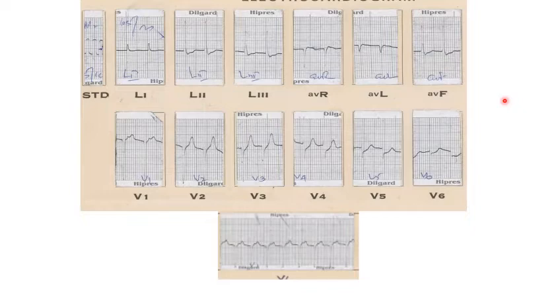And then there is a narrow complex tachycardia, sir, in which P waves we can see just after the QRS complex. Yes. So most probably it will be, sir, AVRT. Okay, it could be an AVRT. Very good. Why did you say it's AVRT? Because we can see P waves, sir. In AVNRT, P is inscribed inside the QRS. Can you sometimes get P outside the QRS in AVNRT?